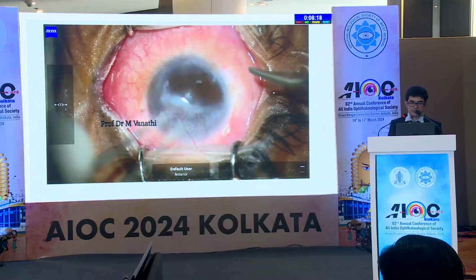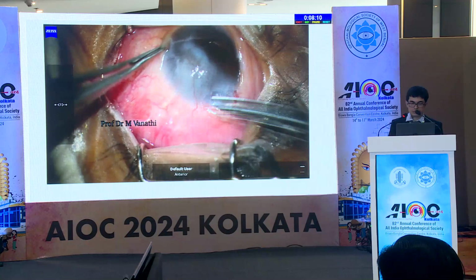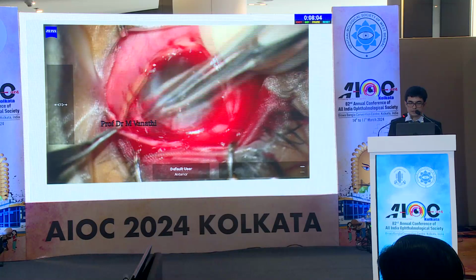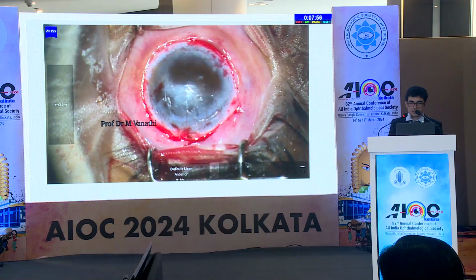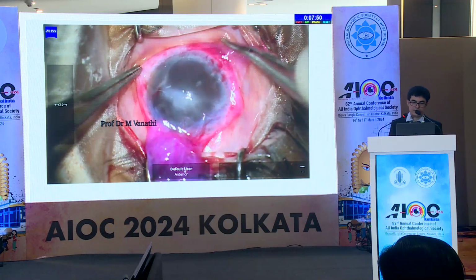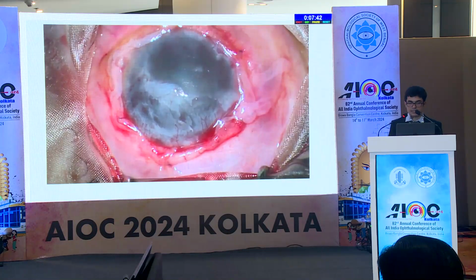and it is stored. So this is the diseased eye, and you can see there is no symblepharon, and we'll do a 360-degree peritomy and achieve hemostasis. Then some pannus removal is done, and you can see there is total hemostasis. Then amniotic membrane is put with the basement membrane side up so that it sticks well, and it is trimmed to the size, and no folded areas are there.